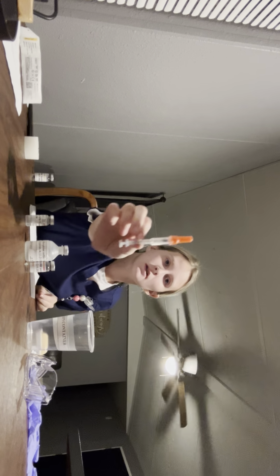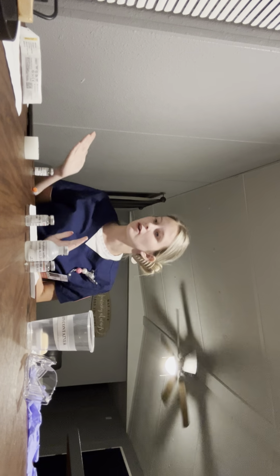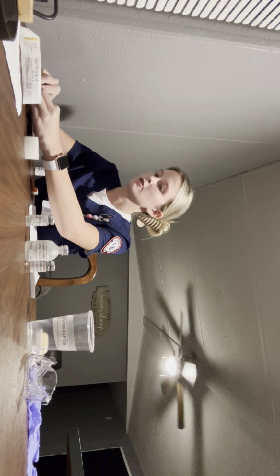Okay, so then you'll do right route, which is given subcutaneously at a 45 or 90 degree angle. So I'm going to grab this 1/2 milliliter insulin syringe and show it to y'all, and it has the units on it. Okay, and then I would do right dose. So this is 100 units, and the syringe is measured in units, and I need 10 units, so I won't have to convert anything.